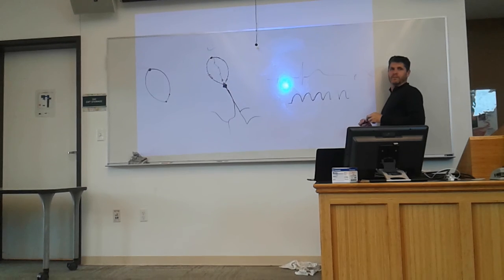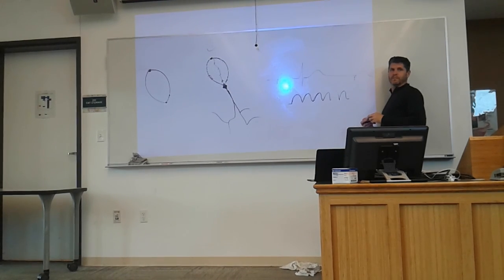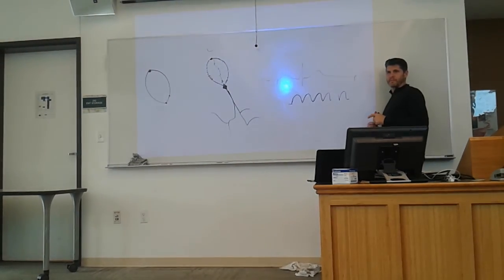During that time, will the P wave always return to baseline, or will it sometimes get triggered before it's returned to baseline? Okay, that's a good question. We can't really tell exactly where the baseline is. It does return to baseline, but it doesn't stay on the baseline.